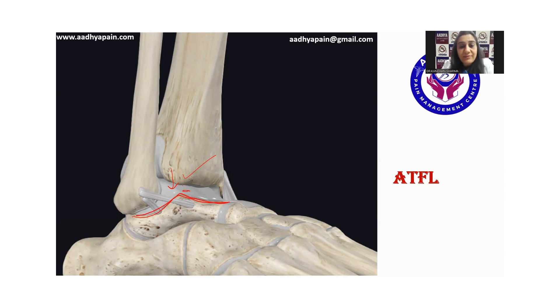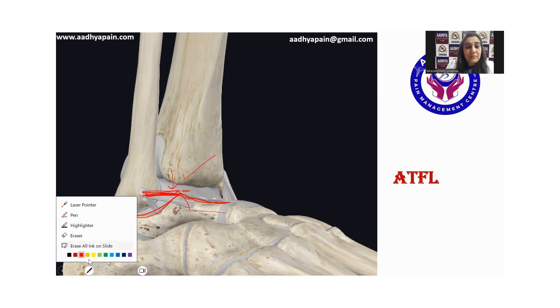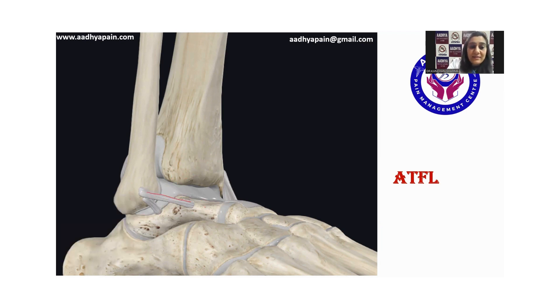Once you have identified the talus with the articular cartilage over it, you are supposed to orient the probe so that the medial side of the probe is lying towards the ball of the great toe. In that manner, you will be able to see the ATFL very nicely.